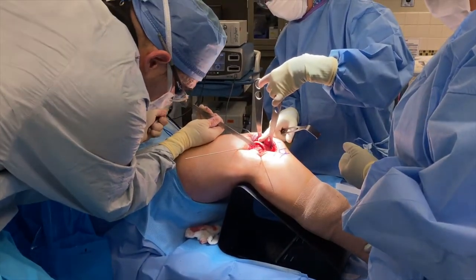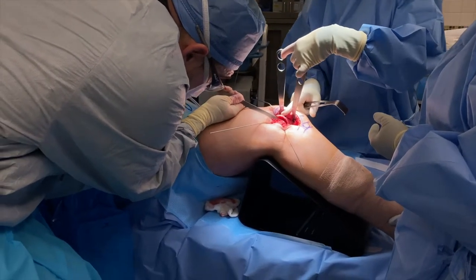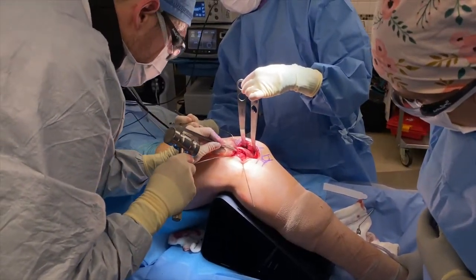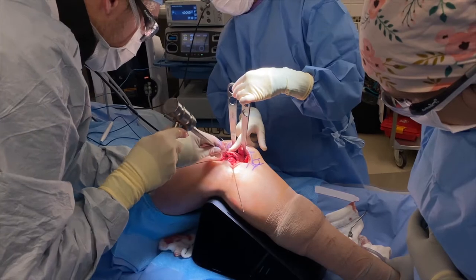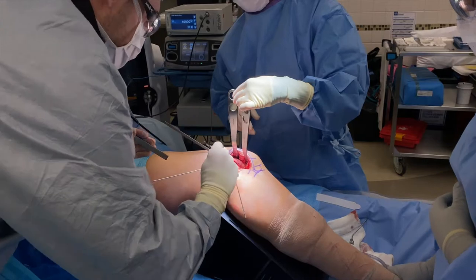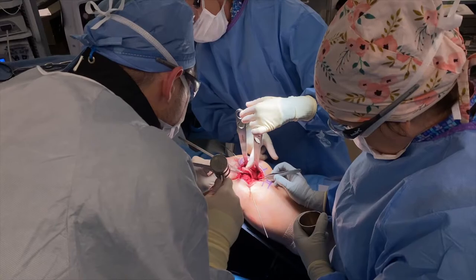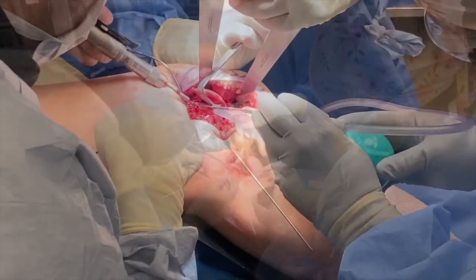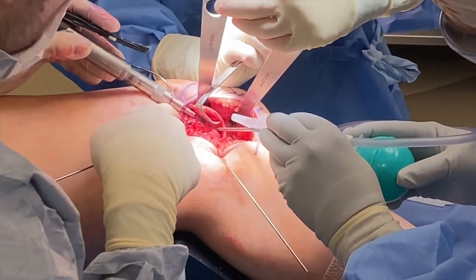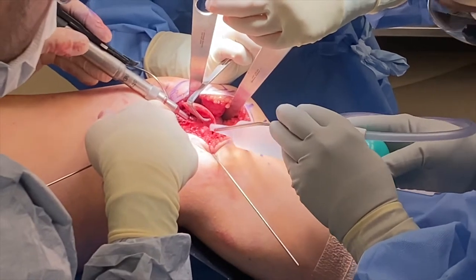Once I've adequately elevated the cartilage, I place one of these osteotomes down the central aspect of the new groove and use that as a reference point to remove bone wedges from both the lateral side and the medial side, recreating that new valley. I'm essentially trying to recreate what we call a lateral trochlear inclination angle of about 20 degrees. We begin by removing those bone wedges, then I use this high-speed burr — a bit like a Dremel tool — to recontour and smooth out those surfaces.